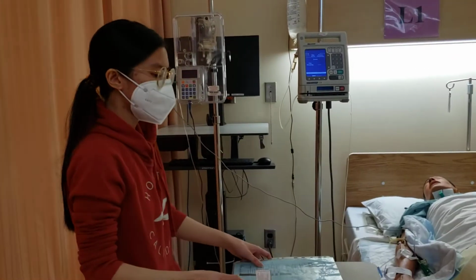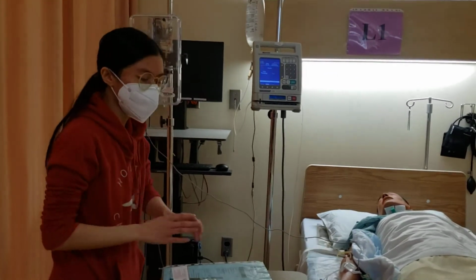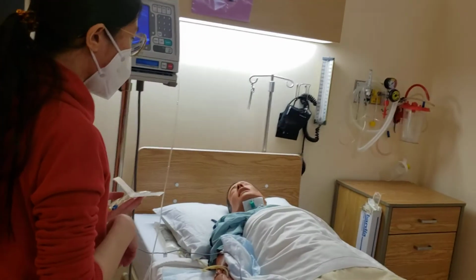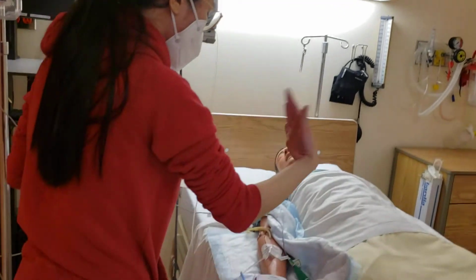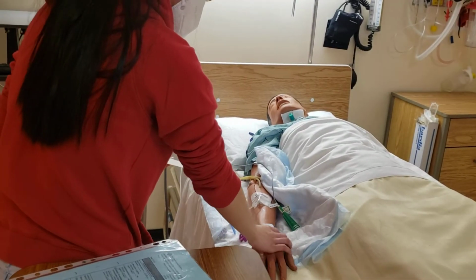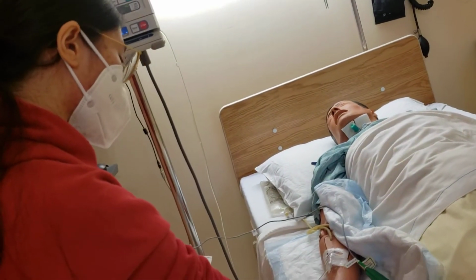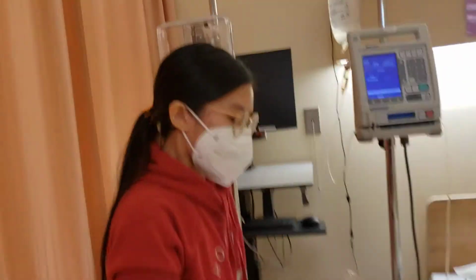I'm just gonna go to my patient's room, and once I get to my patient's room, I'm gonna do hand hygiene and confirm that I have the right patient. So hello, my name is Mariam, student nurse. Can you please state your full name? So Bart Tyson, I confirm that you're my patient. I can also confirm that on their wristband. So Bart Tyson, and then how old are you? 7 years old, so they have the right patient here.